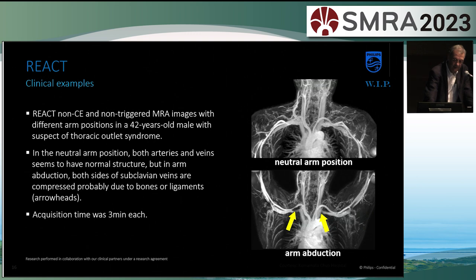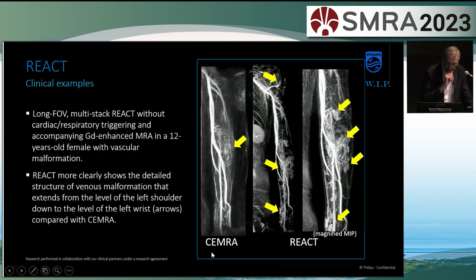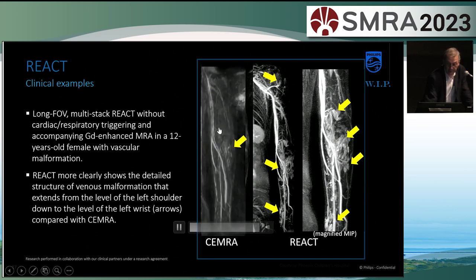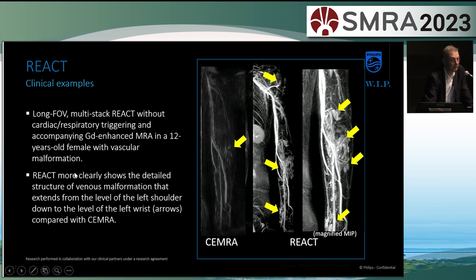Some clinical examples. We did this with a patient with thoracic outlet syndrome. In the neutral arm position, all arteries and veins seem really clear — no problem whatsoever. However, if you go to the arm abduction, or the bonsai position as we call it here, you can see some compression of the vein, probably due to bones and ligaments in the area. So we can see what causes the thoracic outlet syndrome. The acquisition time was about three minutes each for both images. Another clinical example is in children — a 12-year-old female with a vascular malformation. Contrast-enhanced MRI was first used and shows the malformation quite clearly. However, REACT shows the detailed reconstruction of the venous malformation extending from the shoulder all the way down to the wrist, better compared with contrast-enhanced MRI.